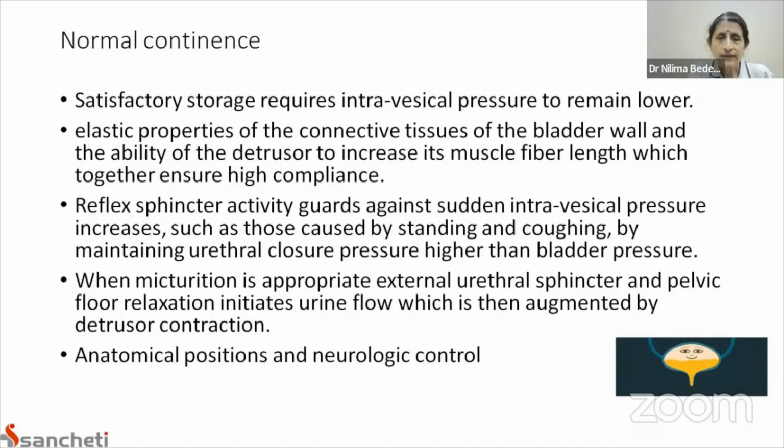That really is another specialty area which needs to be dealt with in detail, which we can discuss at another time. We're talking about only the lower urinary tract dysfunctions here. But the neurological dysfunctions might also require urodynamic studies several times.